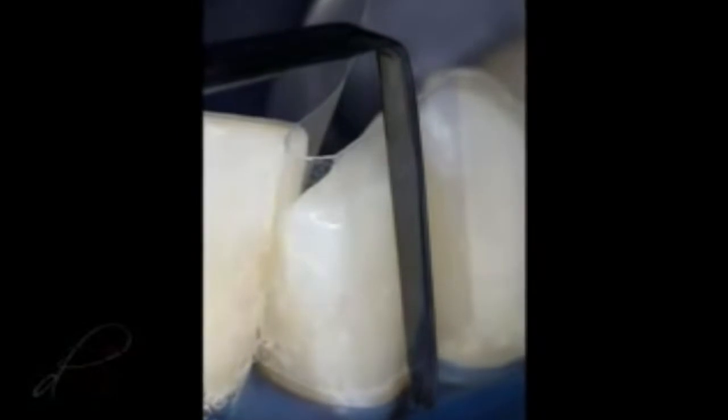A bleach-shaded flowable composite material, G-ænial Universal Flo by GC America, was injected into the preparation, and the syringe tip was slowly removed while extruding the material, and the mylar strip was firmly adapted to an ideal contour and light cured for 40 seconds using a ramp mode.